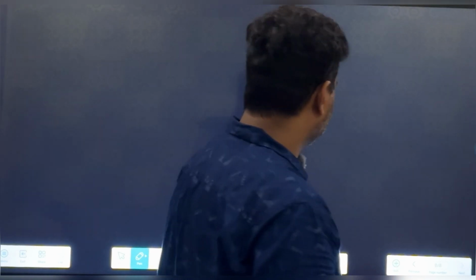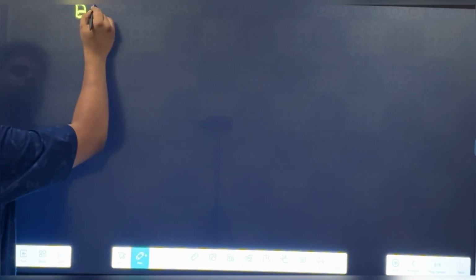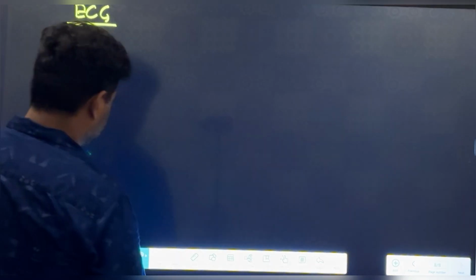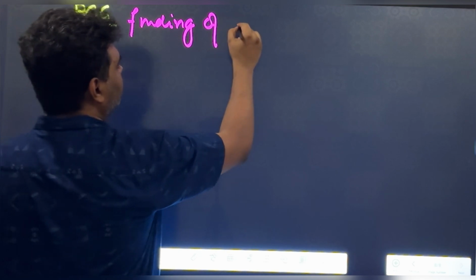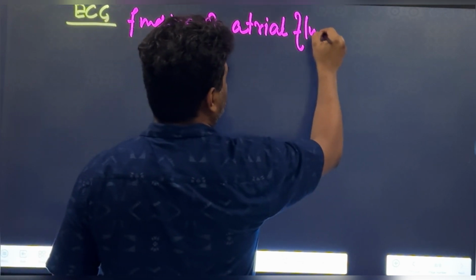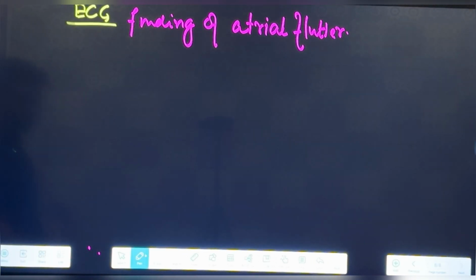Now you should understand what the ECG findings of atrial flutter are.